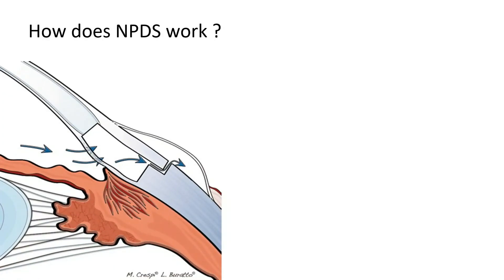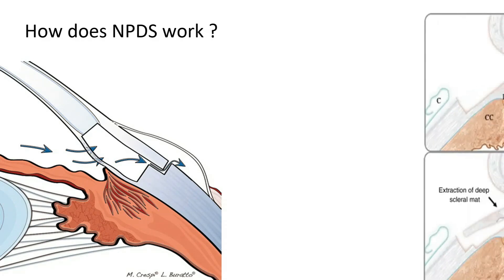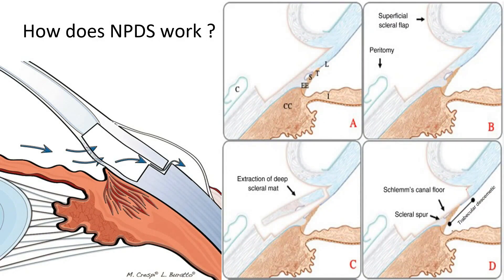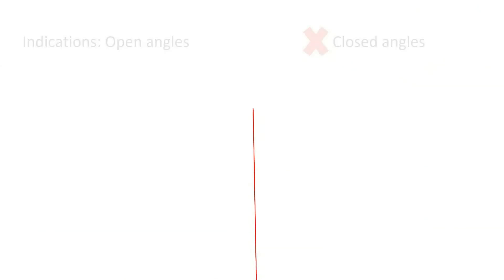In NPDS, we create two flaps — superficial and deep — remove the deep flap, and expose the trabeculo-Descemet window, through which controlled aqueous filtration happens to the scleral lake, thereby reducing the IOP.